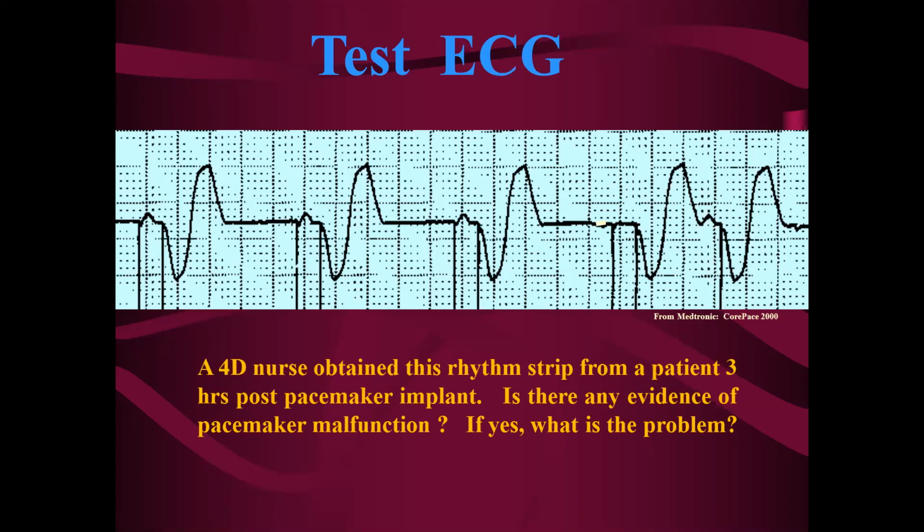Okay? And is the pacemaker behaving normally? Do we have any concerns? Any sensing problem? Any capture problem? In the fifth complex, before the P wave there should be a pacing spike, but it is not capturing. Perfect. In the fifth complex. Not capturing, right? Yeah, it is not capturing. Good, excellent. Good eyes.